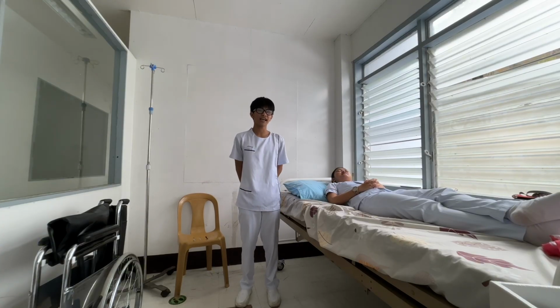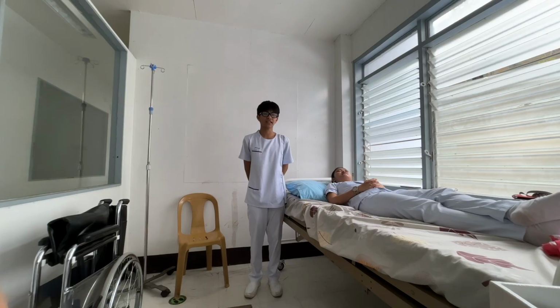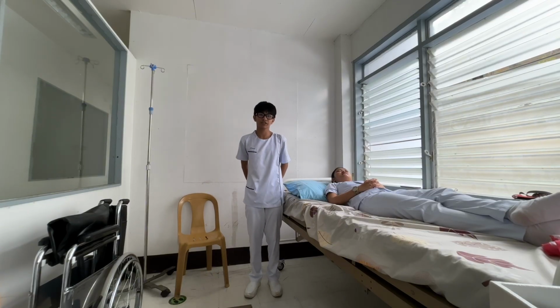Introduce yourself to the client, identify the client's identity, explain what you're going to do, and how the client can cooperate. Next is gather the necessary equipment such as your wheelchair and your waist belt or gait belt. And next is provide privacy and observe proper body mechanics.